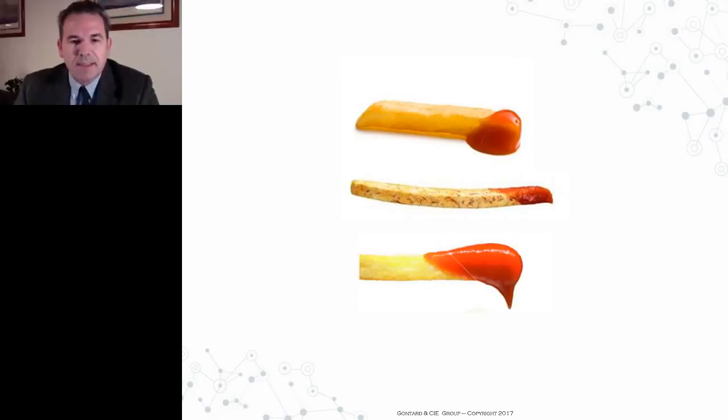So to cut a long story short, we look at the main assays in a laboratory operation as French fry. Each unique assay, and we have about 2,000 in catalog, is represented by an individual French fry. And we look at the cost of technology as the part of the ketchup on the French fry. So you will tell me, okay, but I have 2,000 catalog objects, 2,000 unique assays, that's a lot of French fries, I might get an indigestion. I would say you're not wrong, and therefore over the time we have noticed that the Pareto law applies to laboratory medicine.